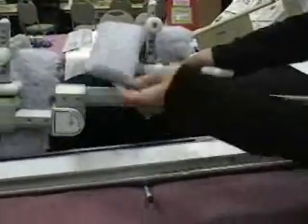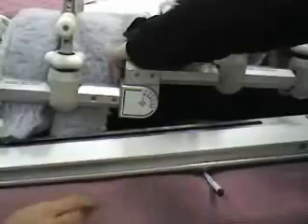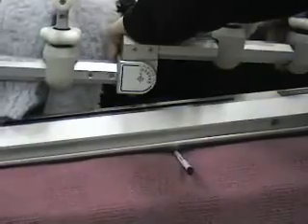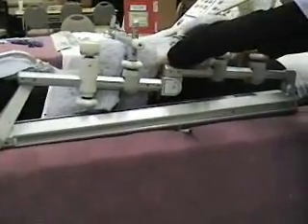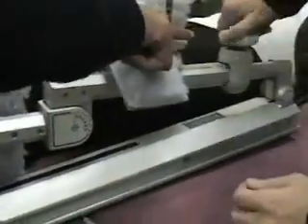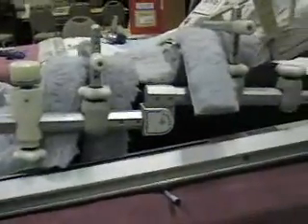Once you get the knee axis marked, turn the machine on and it will telescope up to that axis. It's moving toward where the pen mark is located — now we're lined up with the knee. Once aligned, lock that knob.